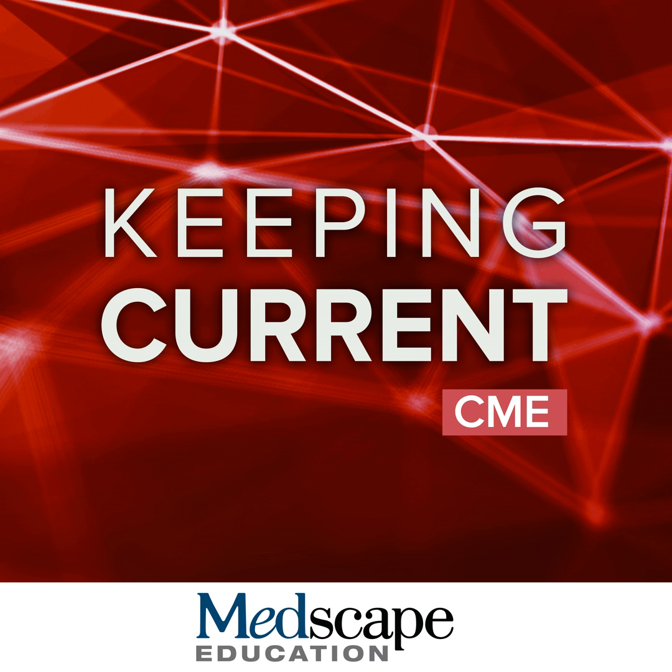Traditionally, black blood T2-weighted imaging is the workhorse for that, and many centers still use it. I think it's excellent for visual evaluation of edema, where we would be looking for myocardial high T2 signal or hyperintensity. That's really important to tell us what's going on in a very acute setting, about the fluid in the myocardium, in this case in a patient with an acute infarct in the setting of ischemia and myocardial injury.